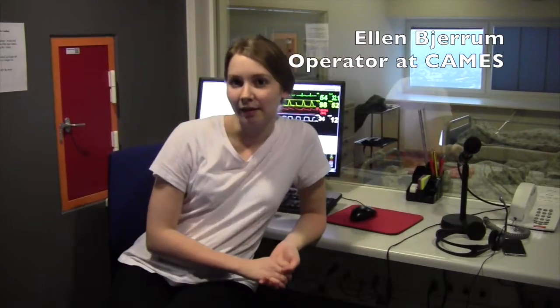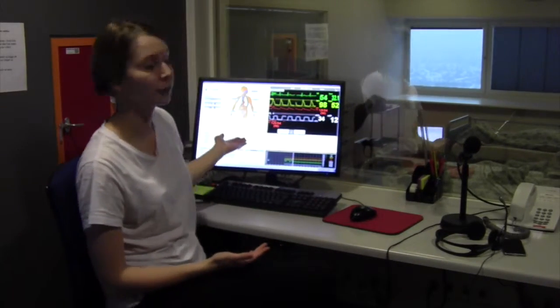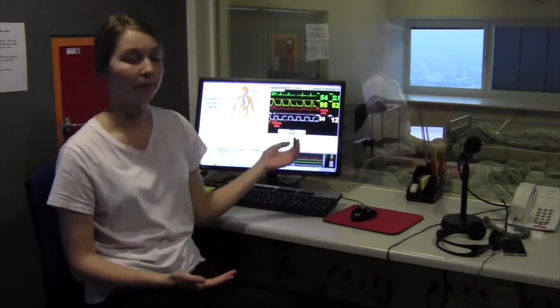Hi, my name is Ellen and I'm a medical student here at CAMES. I will give you a short introduction to the operator room. The most important equipment in the operator room is the computer that controls the mannequin and the computer that controls the recording.